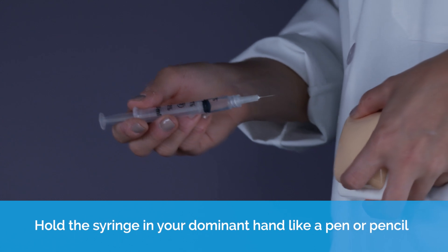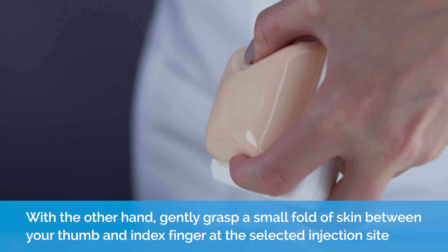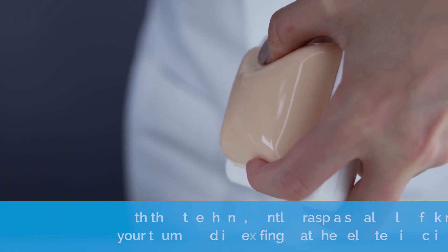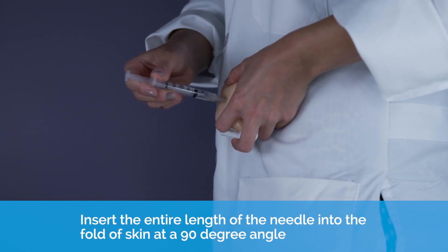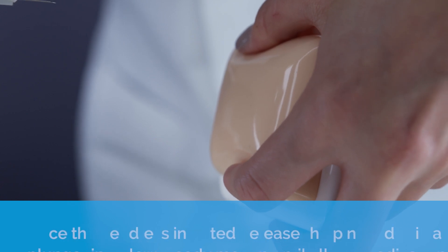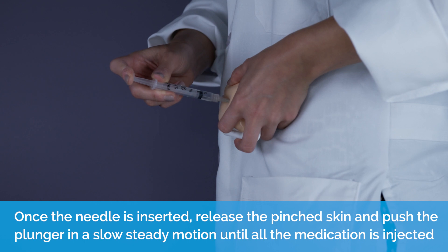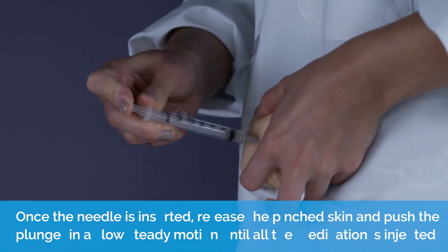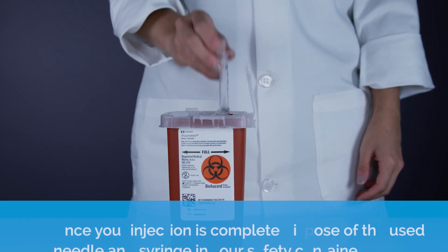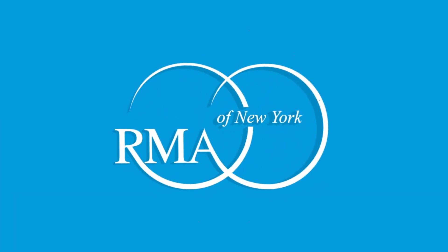Hold the syringe in your dominant hand like a pen. With the other hand, gently grasp a small fold of skin between your thumb and index finger at the selected injection site. Insert the entire length of the needle into the fold of skin at a 90 degree angle. Once the needle is inserted, release the pinched skin and push the plunger in a slow, steady motion until all of the medication is injected. Gently withdraw the needle. Once your injection is complete, dispose of the used needle and syringe in your safety container.